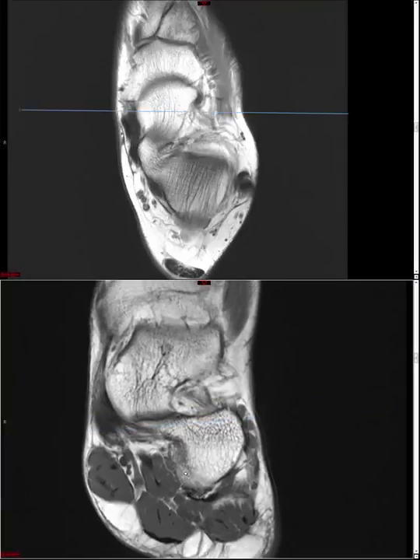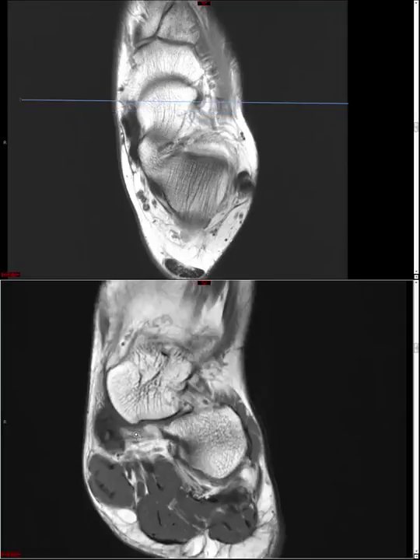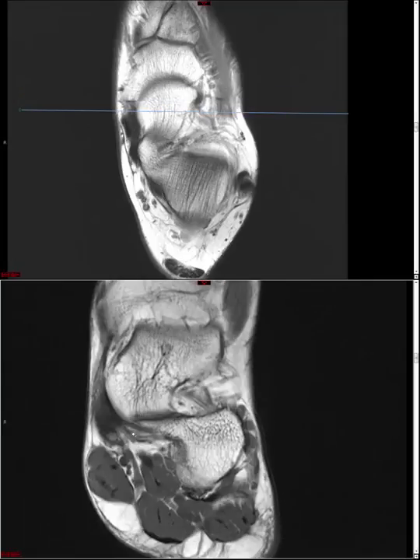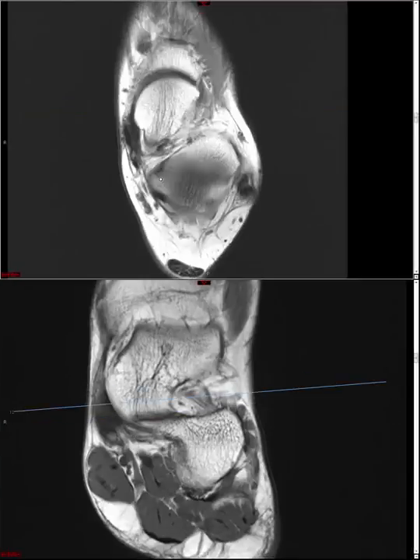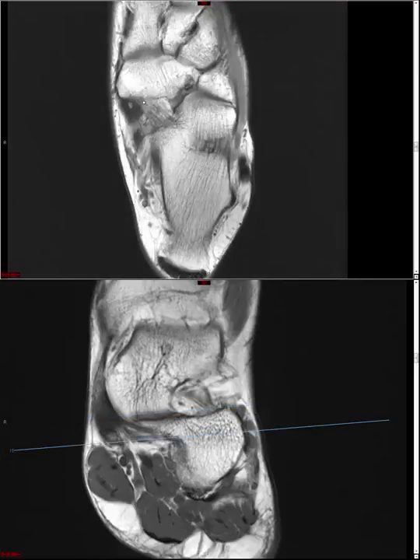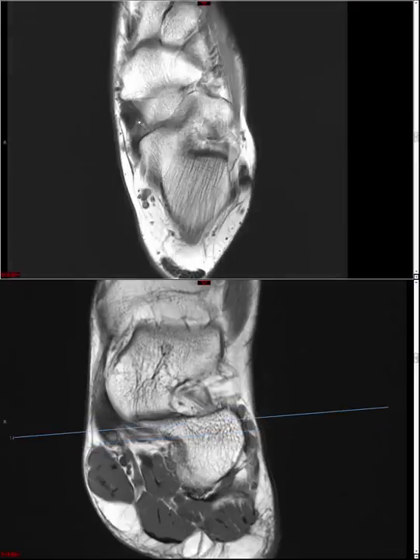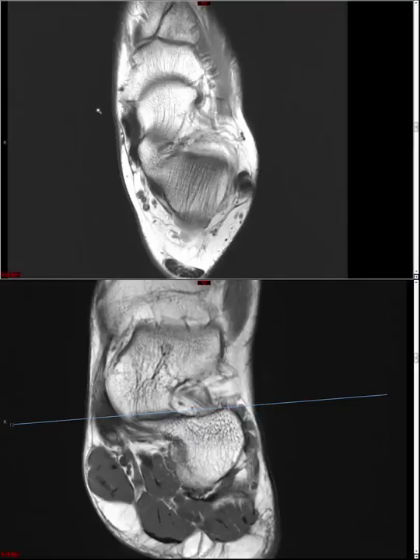On your fluid-sensitive fat-saturated sequence, look for fluid signal in the spring ligament location to diagnose a tear. The intermediate or medial plantar component and the inferoplantar or lateral band of the spring ligament are less important. Focus on the superomedial oblique portion, which is also nicely seen on ultrasound — you'd see PTT, flexor digitorum longus, and then a fibrillar structure corresponding to the superomedial oblique portion of the spring ligament.